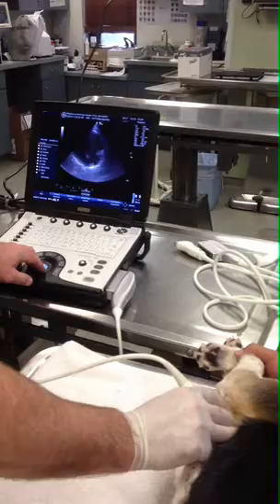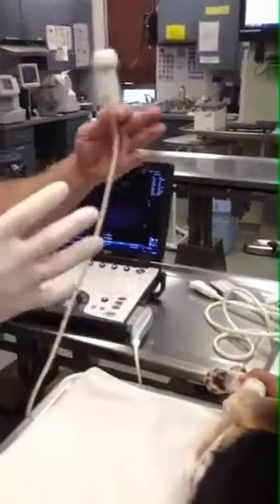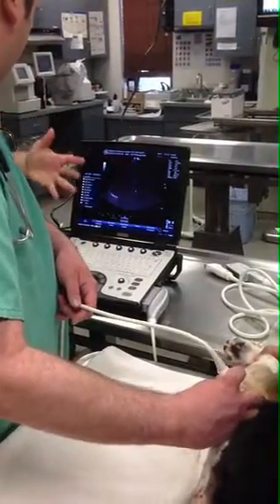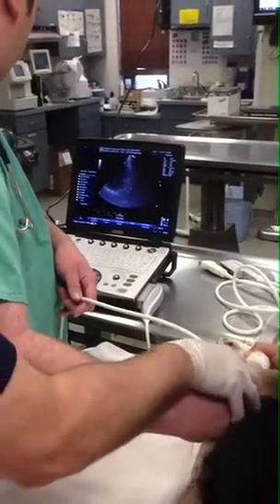Stay sternal. And again, if this were a pericardial effusion dog, you wouldn't even have to do that because your window would be monstrous. If you get lung in the way, push down with your fingers and stay sternal.